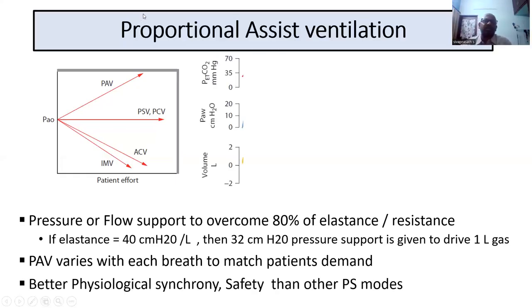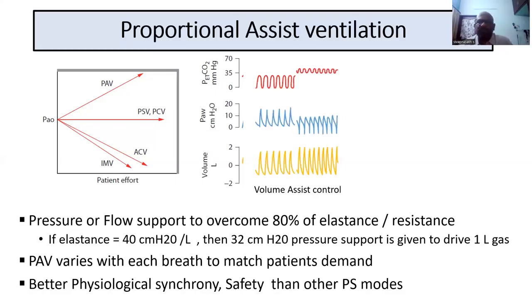Say I have set end-tidal carbon dioxide, airway pressure and volume. Now for a spontaneously breathing patient, in various modes, I'm going to give carbon dioxide to him, or make him hypercapnic, and see the response. In volume assist control, suppose this patient is on a ventilator and is spontaneously breathing, and his carbon dioxide level goes up.